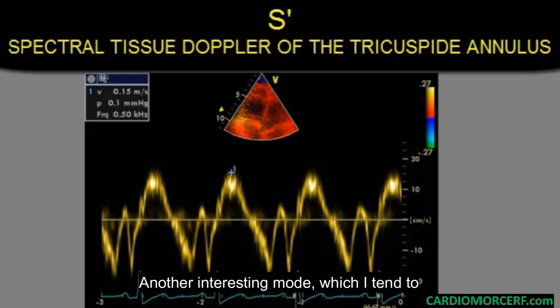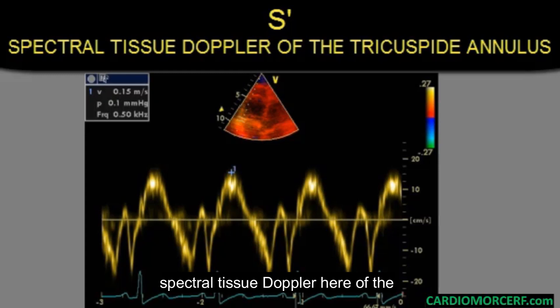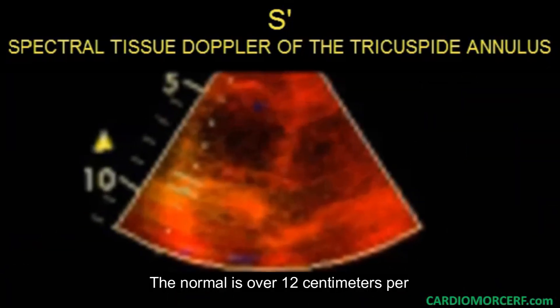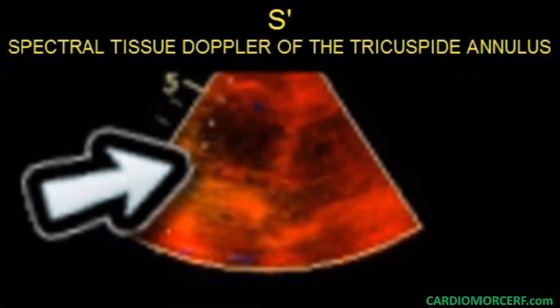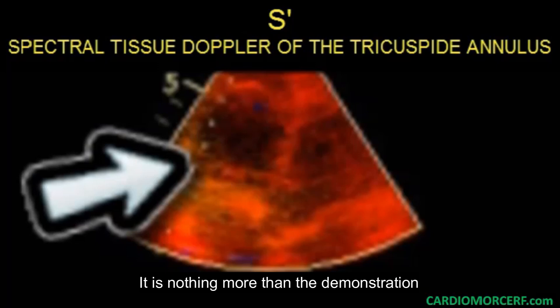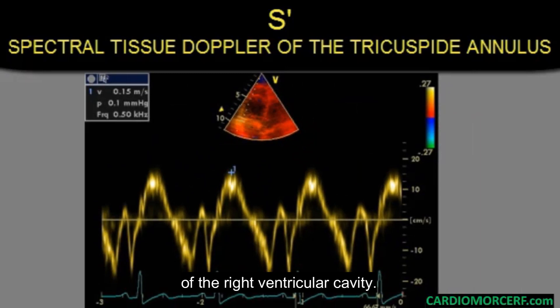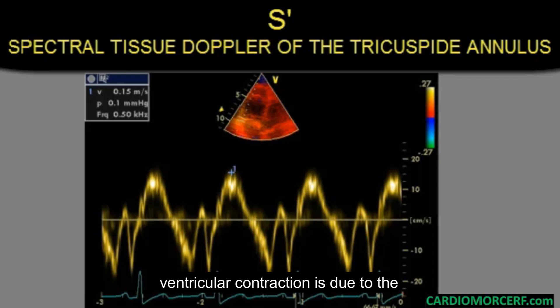Another interesting mode, which I tend to use under certain conditions, is the spectral tissue Doppler of the tricuspid annulus. The problem is that it is not very sensitive; the normal is over 12 centimeters per second. It is nothing more than the demonstration of the longitudinal velocity of the decrease of the right ventricular cavity. As we have seen, much of the right ventricular contraction is due to the cavitary reduction in this direction.